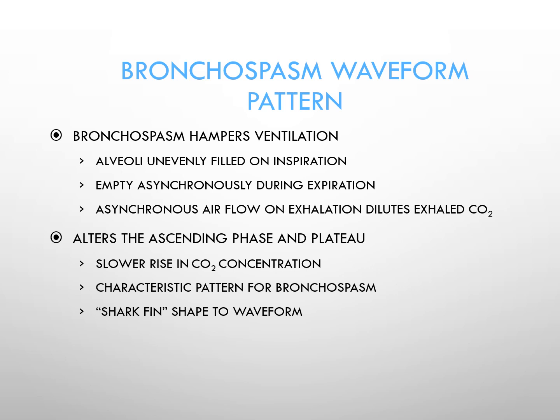So what it ends up doing is altering the ascending phase and the plateau. You have a slower rise in CO2 concentration. You get the characteristic pattern that typifies a bronchospasm, and again, it's crudely referred to as a shark fin shape to the waveform.